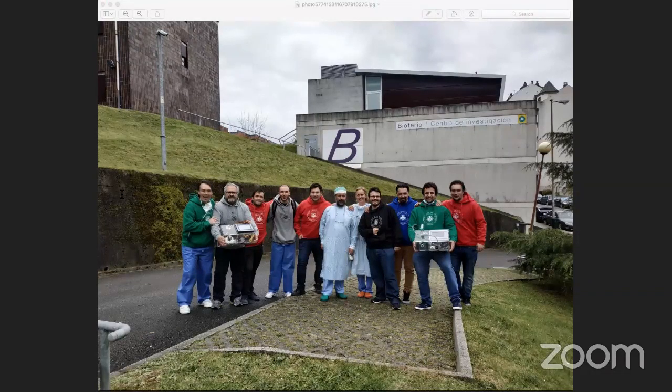So we tested it like a week ago with a little pig. We call her Peppa Peep because of the PEEP function. It was great, but it was a test for a healthy patient. And yesterday we did it with very great success. As you see in the photograph, everyone is happy. We tested it on animals, simulating the worst situations with liquids flowing in the lungs that you have in COVID patients. So the machine worked really great.